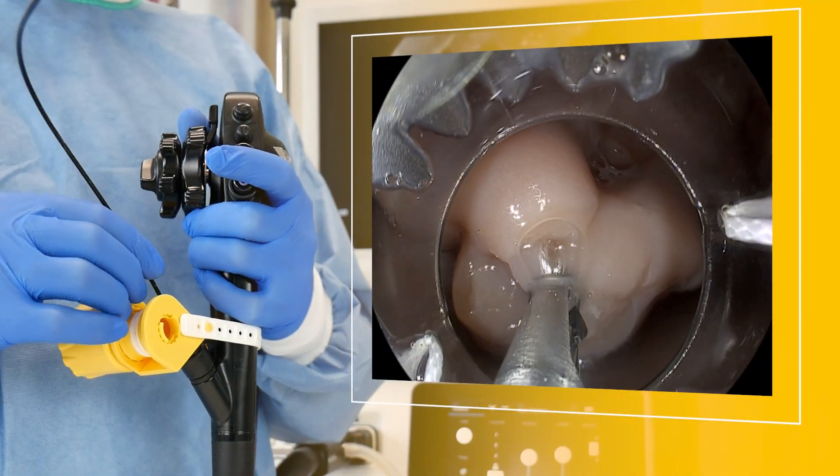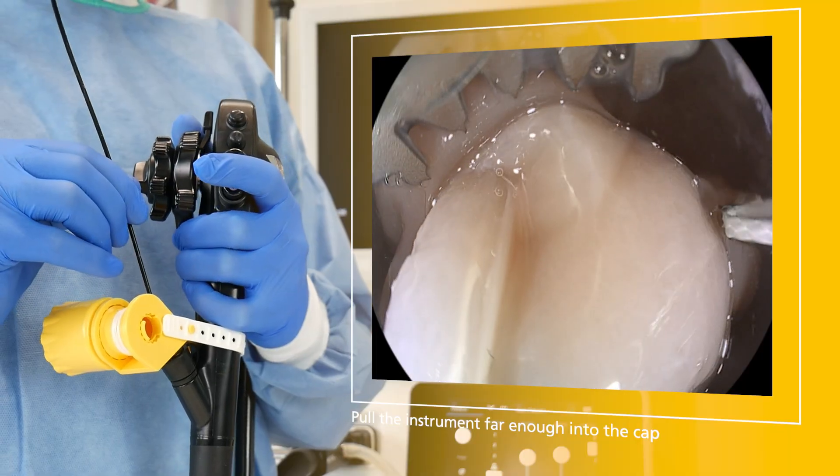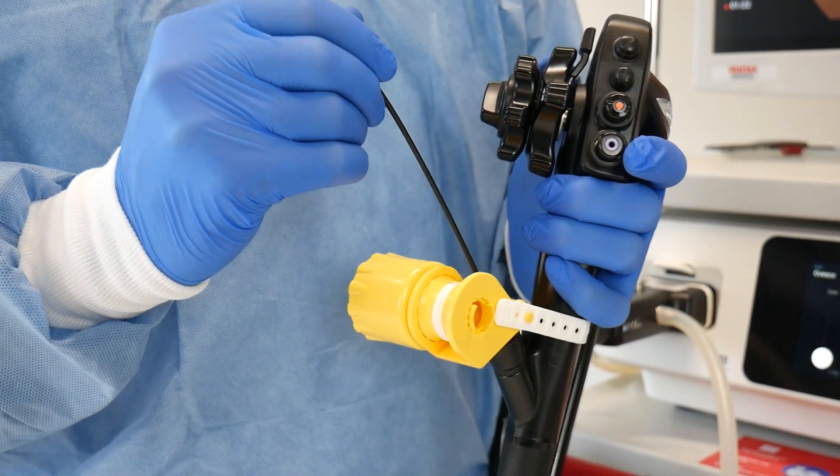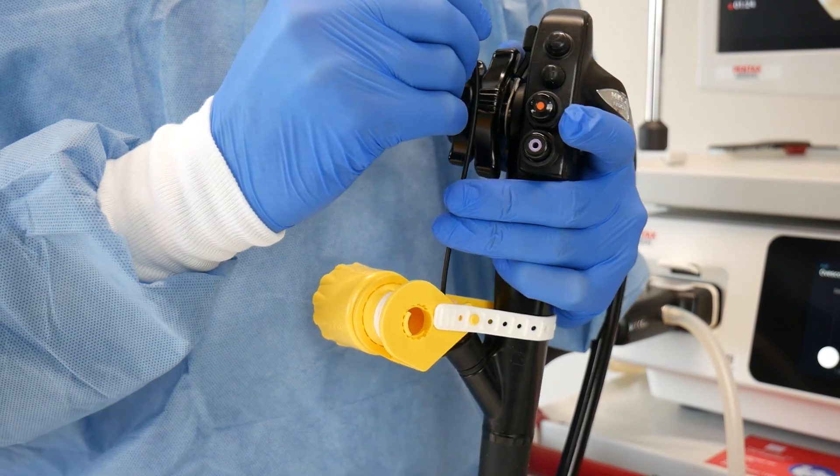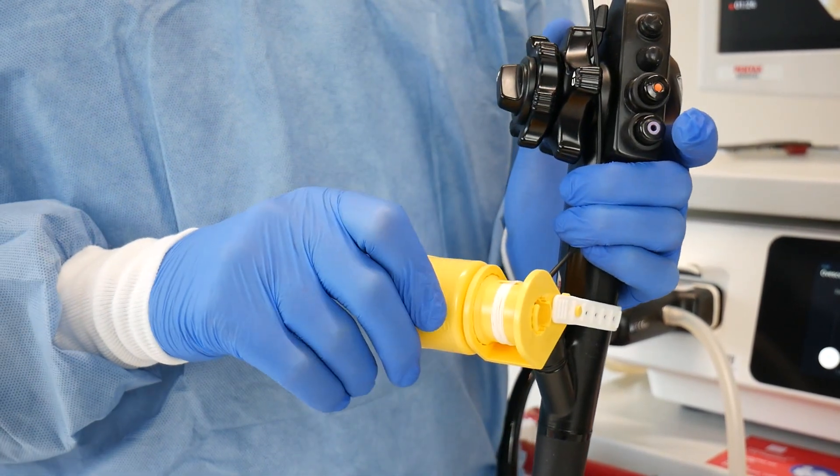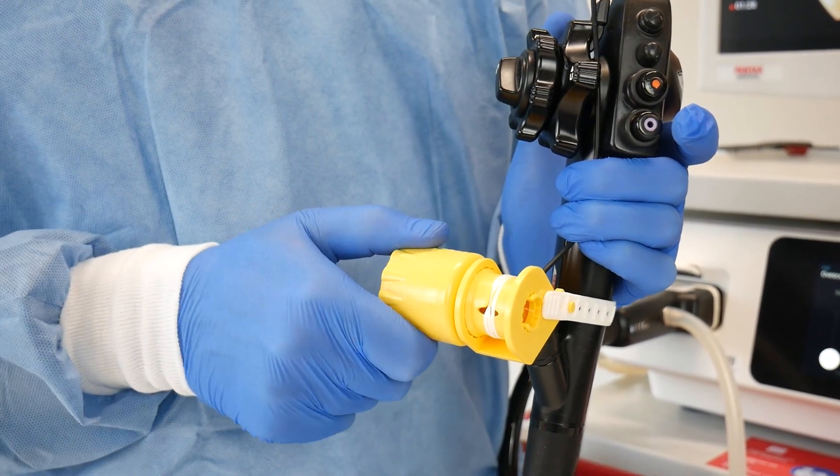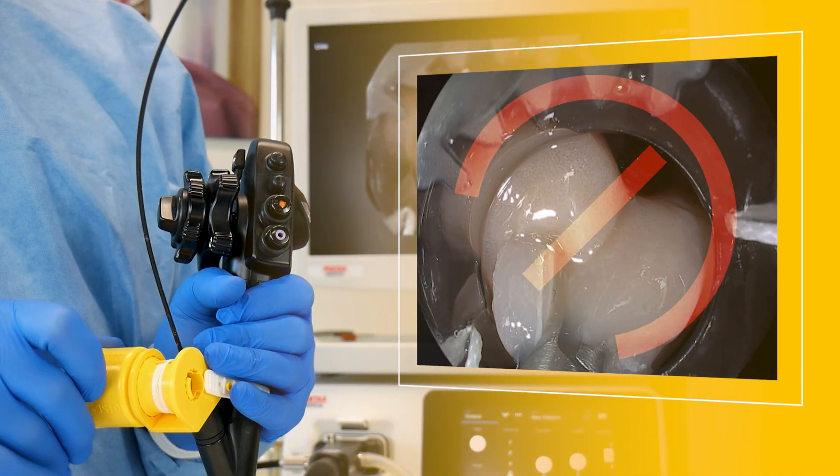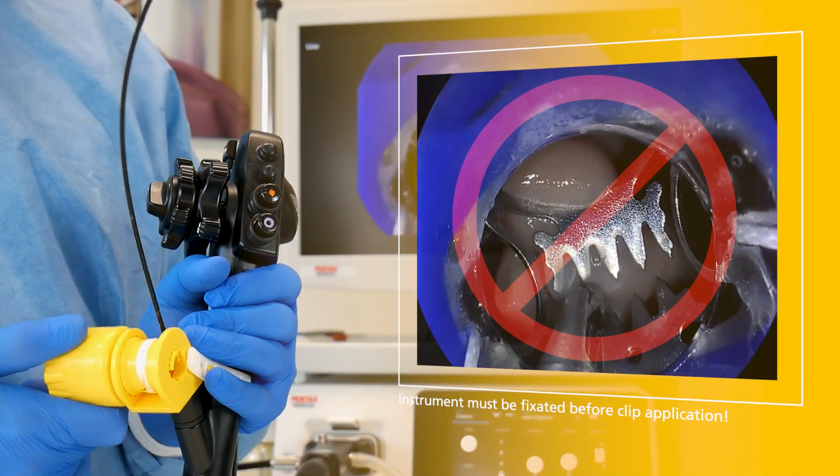Ensure that the tip of the instrument is sufficiently retracted into the cap before clip application. To ensure that the instrument does not move during clip deployment, fix it to the endoscope with your fingers. This prevents the clip from being applied to the instrument shaft and the instrument from being fixed to the tissue.